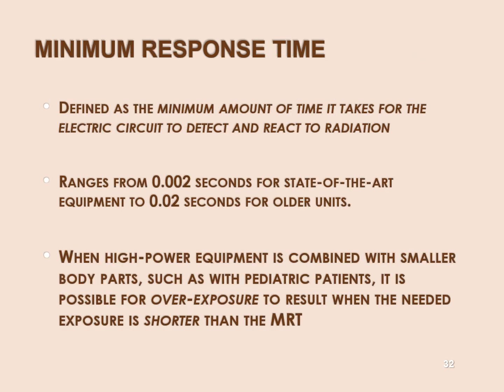Okay, minimum response time. I demonstrated this with the overhead lights. Any electric circuit's got a little bit of lag. If there's capacitors involved, you definitely have lag. It becomes a noticeable lag because capacitors take a while to discharge. They have what's called a static voltage.